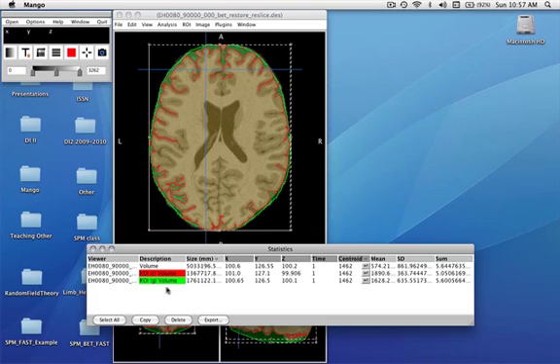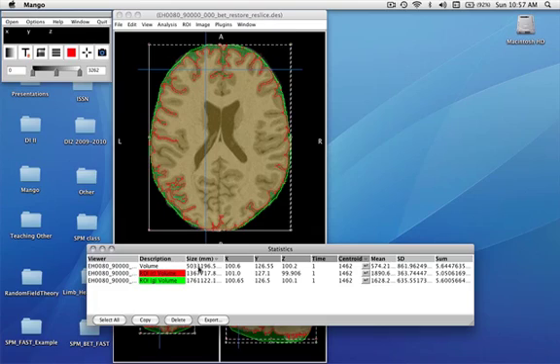If the region you were using were aligned, this would be in millimeters. If the region you were using were area only, this would be in area units. If you click it, if there's a little arrow, that means there are some other options here. We can switch between voxels and actual size in cubic millimeters.